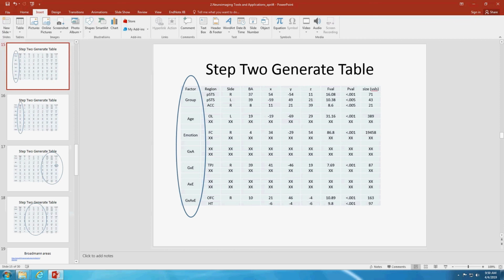Auditory stimulation or language, people could do something with language. Find the language area in each person, and then take that and use it in an SPSS kind of approach.